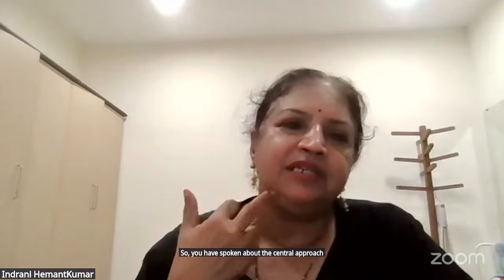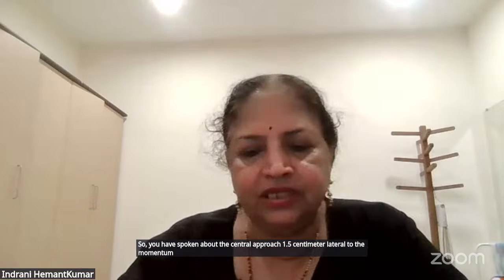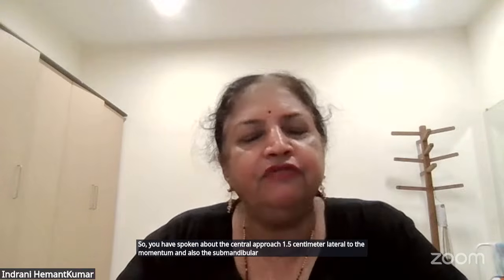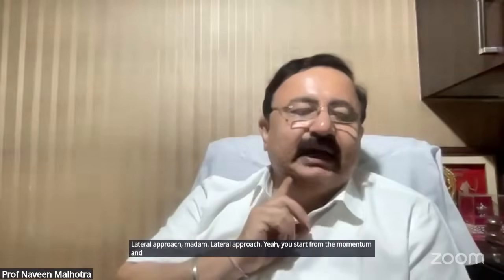Most welcome, madam. Sir, you have spoken about the central approach, 1.5 centimeter lateral to the mentum, and also the submandibular approach, right? Which do you think is safer and best with least complications? Lateral approach, madam. 1.5 centimeter lateral. You start from the mentum and go 1.5 centimeter lateral.